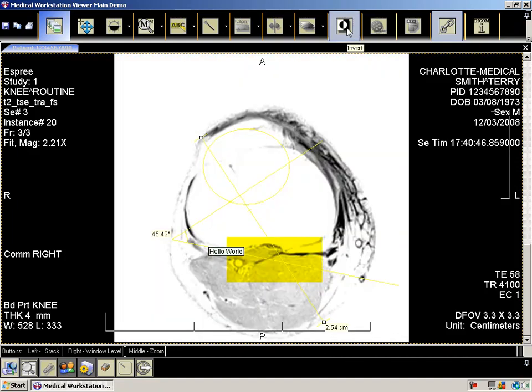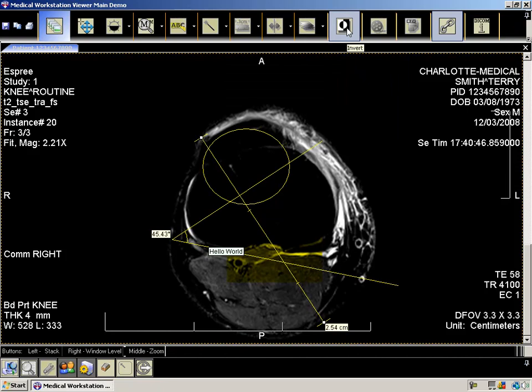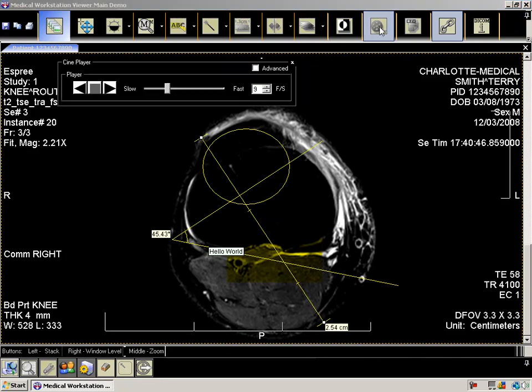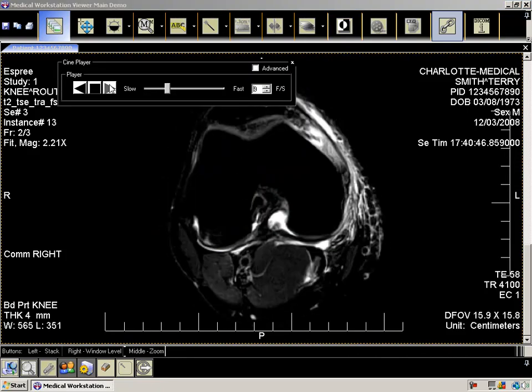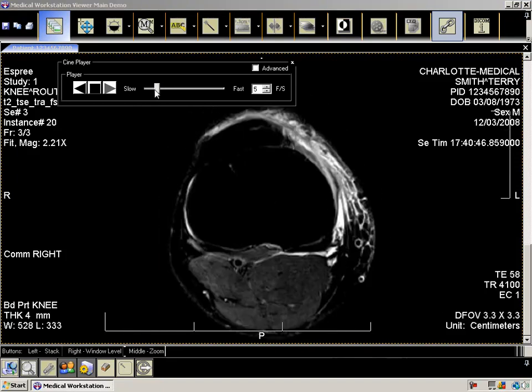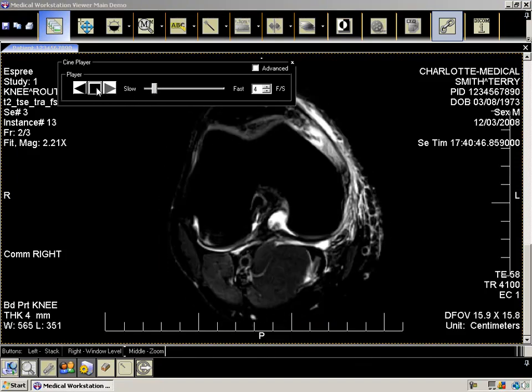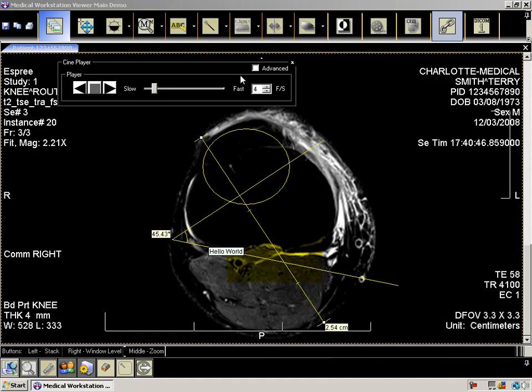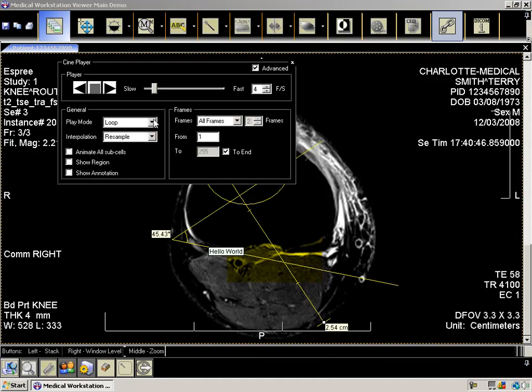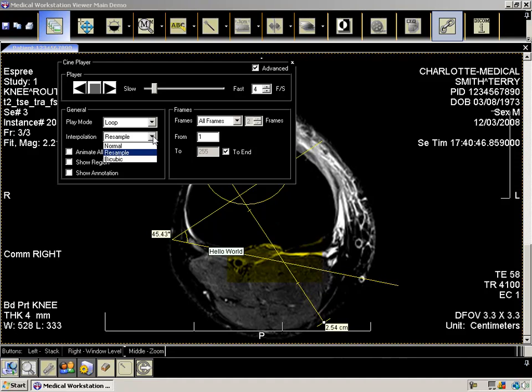There is a button specifically for inverting the image. The Cine player will play each frame in the selected series sub-cell. You can also change the view to stack and play the Cine. The advanced options on the Cine player allow you to alter the order of the image's playback, alter the interpolation, animate all sub-cells, and display regions and annotations during animation. You can also adjust which frames are displayed.